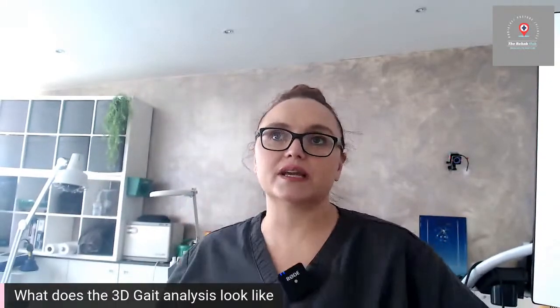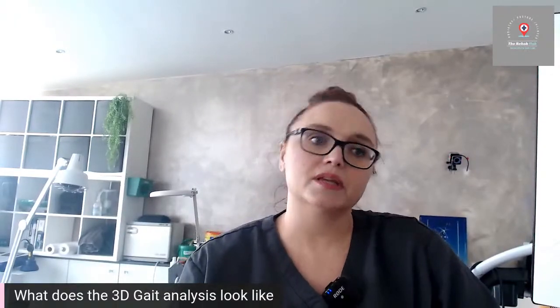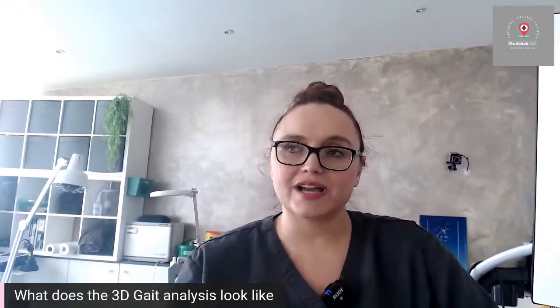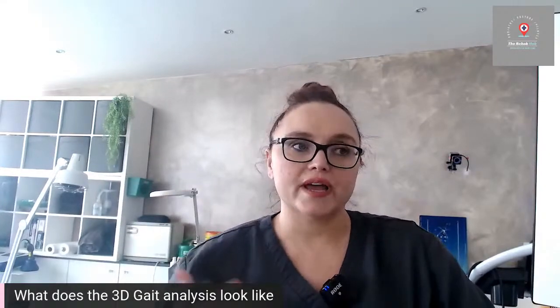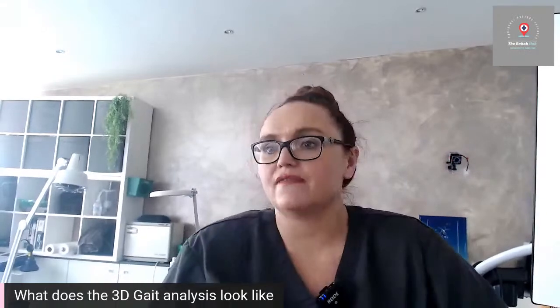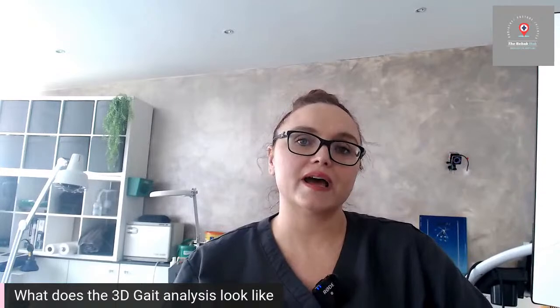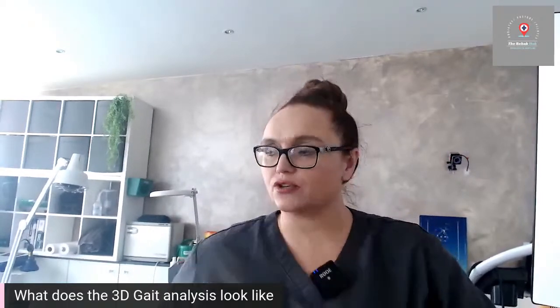So it's at that research standard. As I said, this was developed by Run3D, a spin-out company out of Oxford University. It is at the standard that it is gold standard at that research hospital, university hospital level. So it's the first time this has really been available to the general public. You haven't really had this sort of in-depth, thorough analysis available to you. It is pretty new.